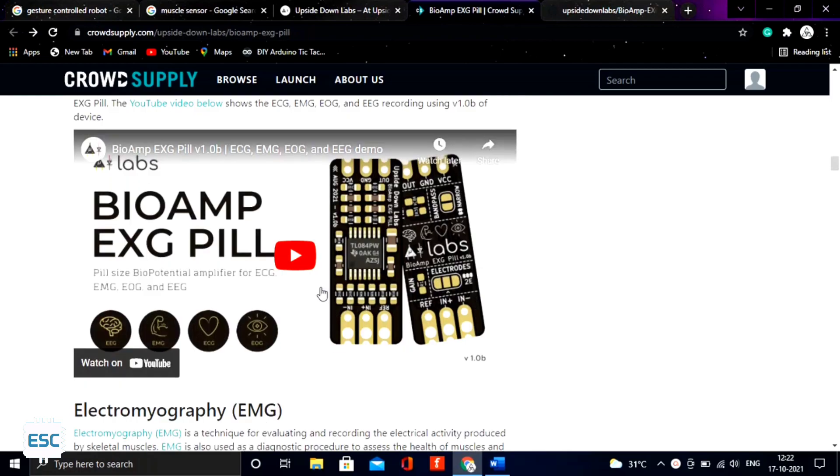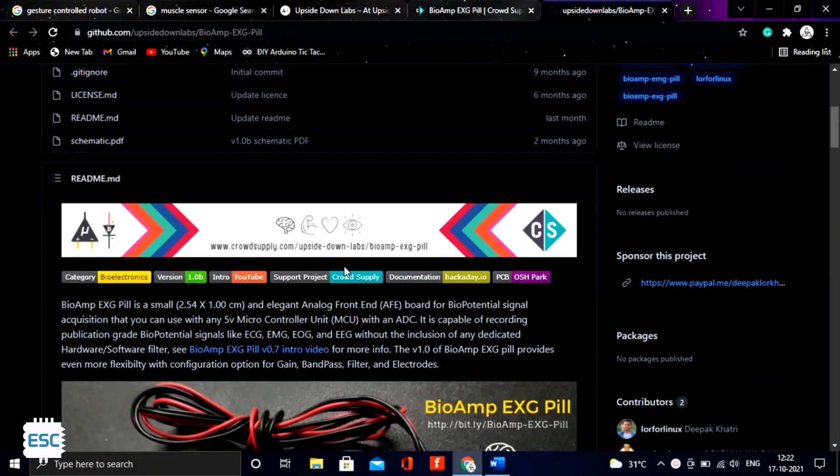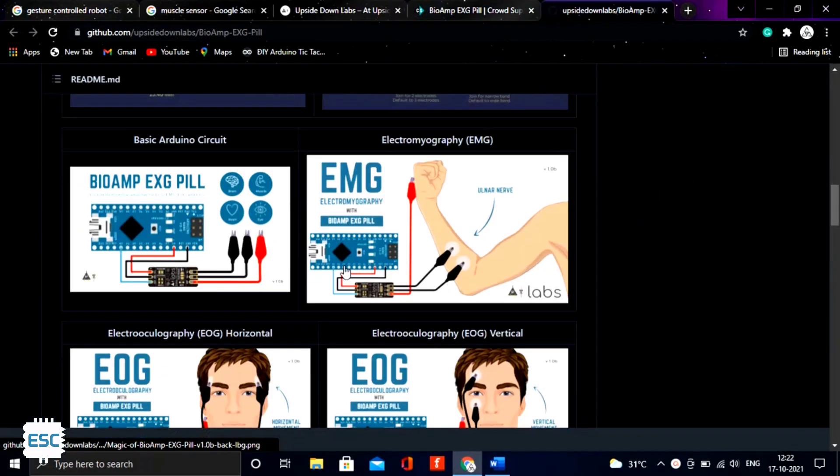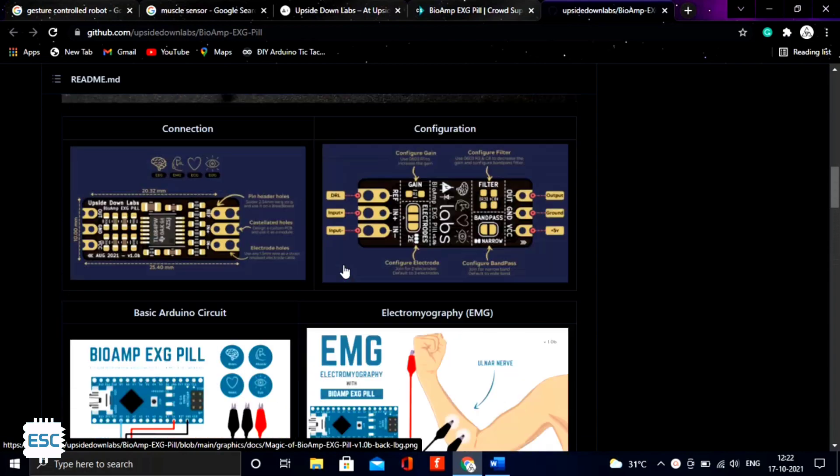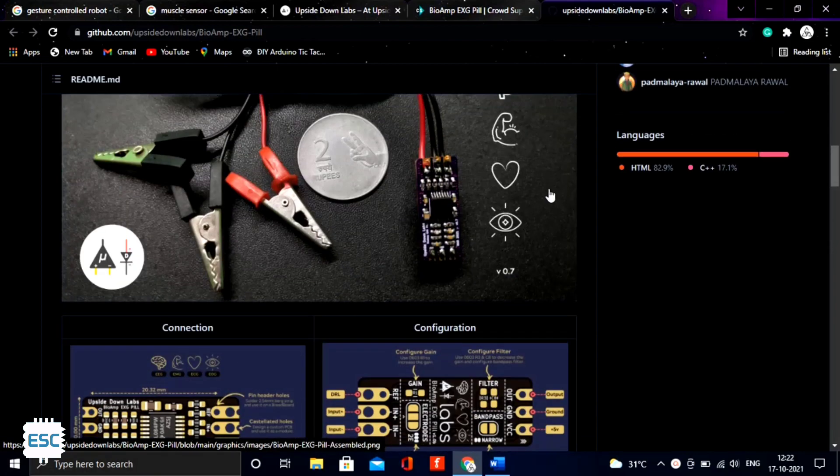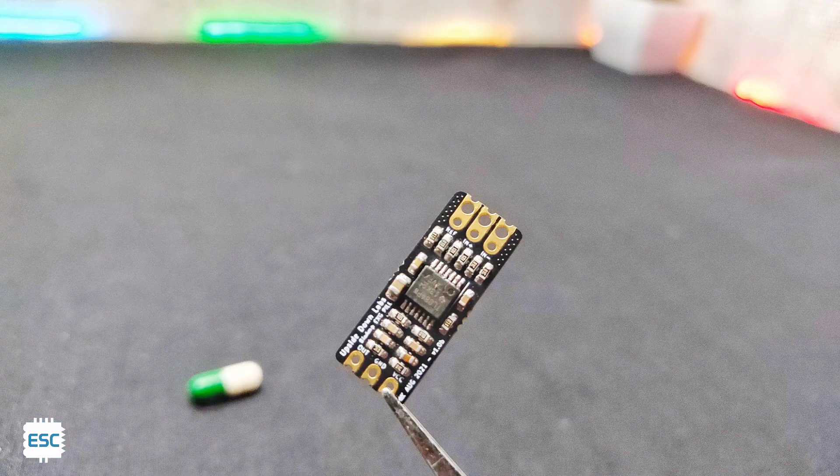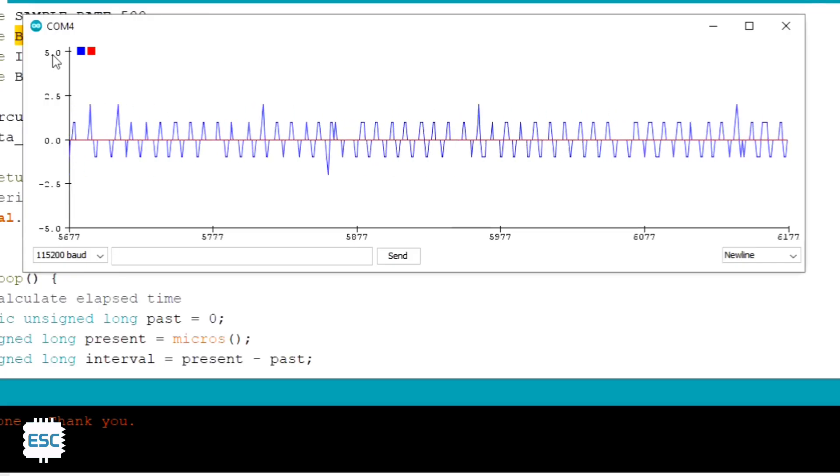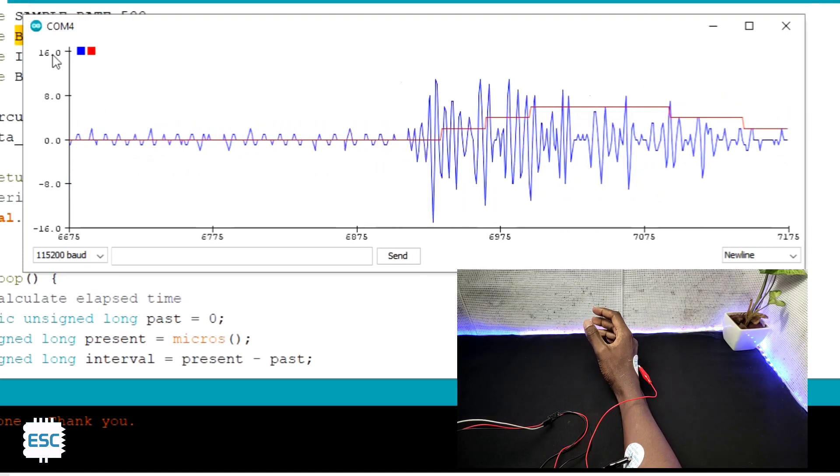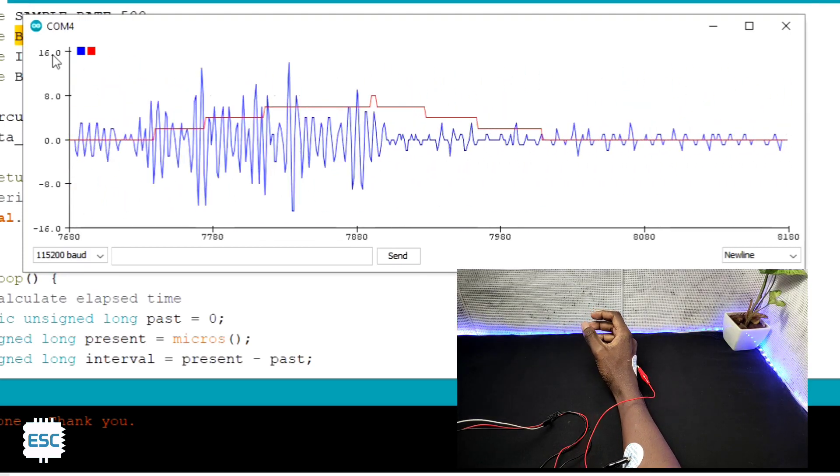The EXG Pill is a biopotential amplifier. This tiny board not only records muscle activity but can also measure EEG, EOG, and ECG. I think this is why they gave it the name EXG Pill. In this video, I'm going to show you how to interface the EXG Pill with Arduino and how to read EMG. So let's start.